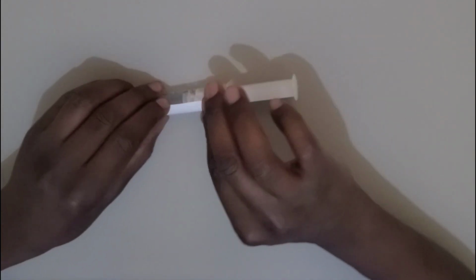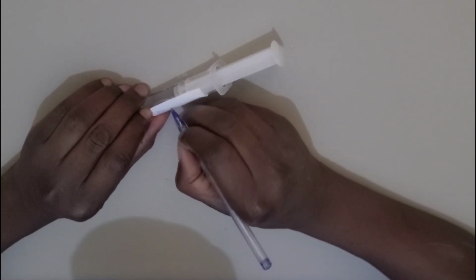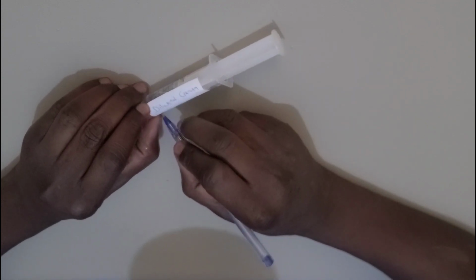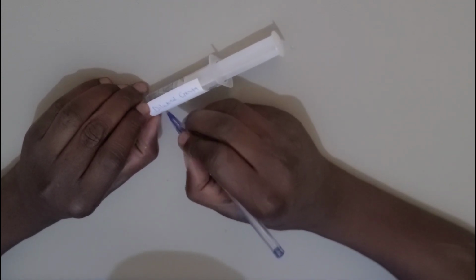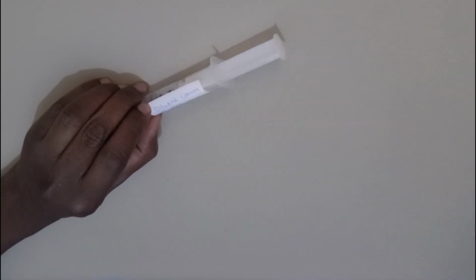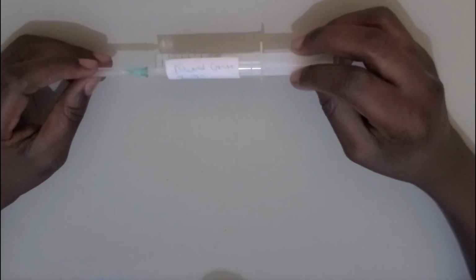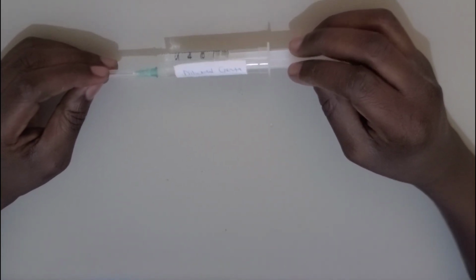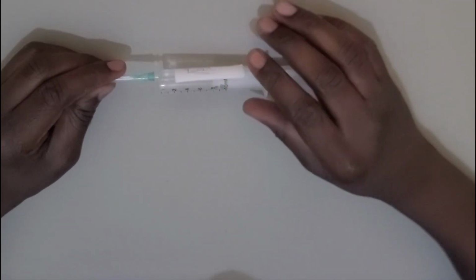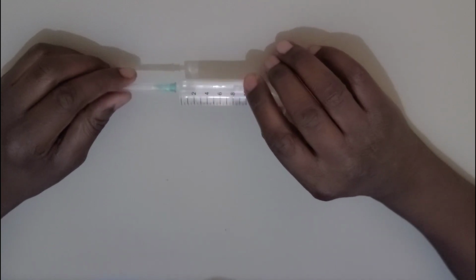After diluting, you need to label the medication: diluted Genta. You write the date for today and the time. The time is maybe 4 p.m. It's so that if someone comes across the medication, they will see the time it was diluted and the date, so that they do not reuse it and just discard it when the drug is no longer usable. So that is all.